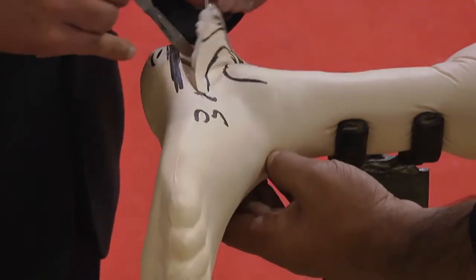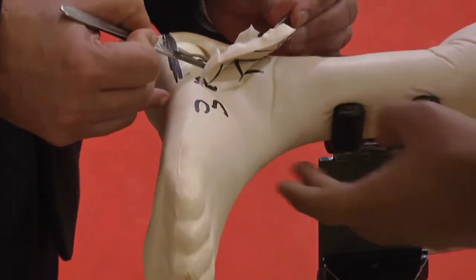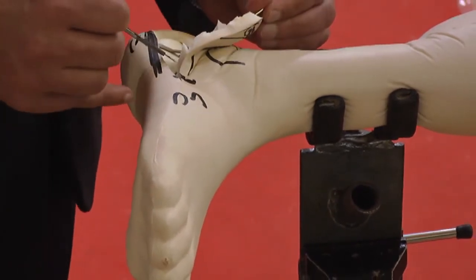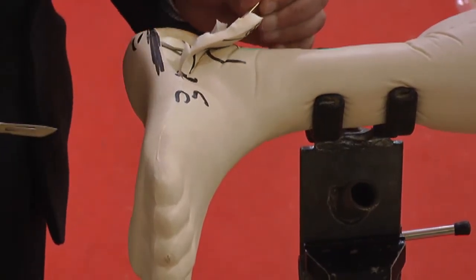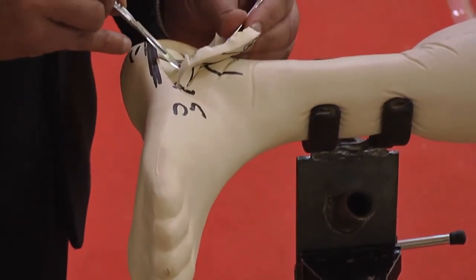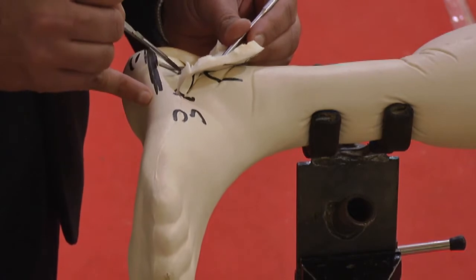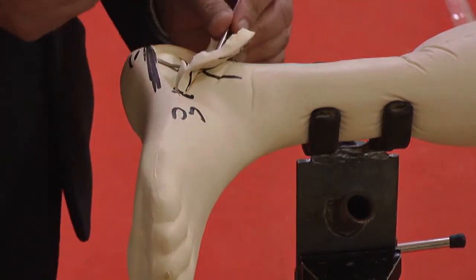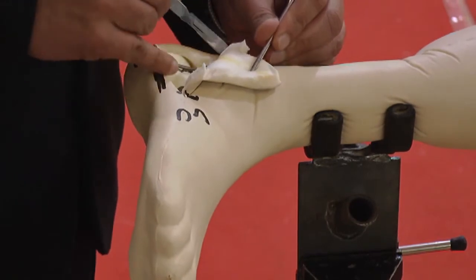You continue this dissection without holding the flap at all, unless you reach this area here, which is the peroneal tubercle, but you will not be seeing the peroneal tubercle, obviously. Here you will be seeing a shiny tendon coming into view, that is the peroneal tendon. And your dissection then continues below the peroneal tendons, and your retractor comes into play, and the peroneal tendon is retracted. As you retract the peroneal tendon, the deeper part of the peroneal sheath is continuous with the calcaneofibular ligament, so you will dissect that off the bone, and with that the tendons will be retracted with the flap.